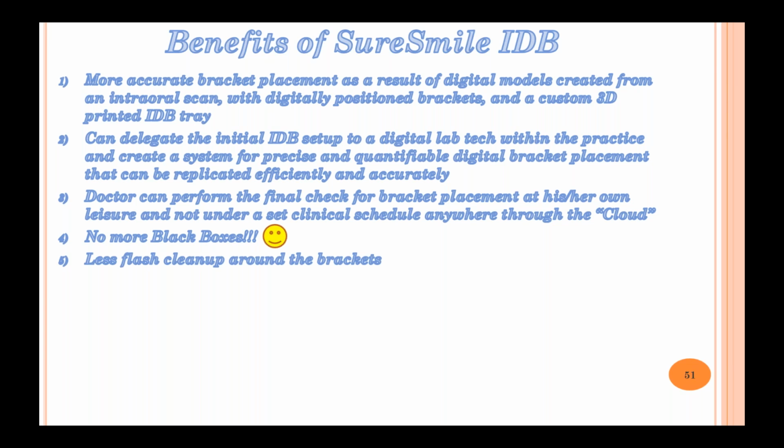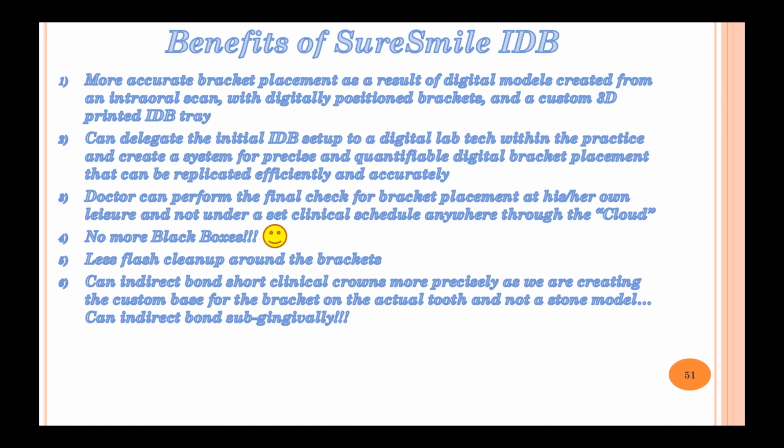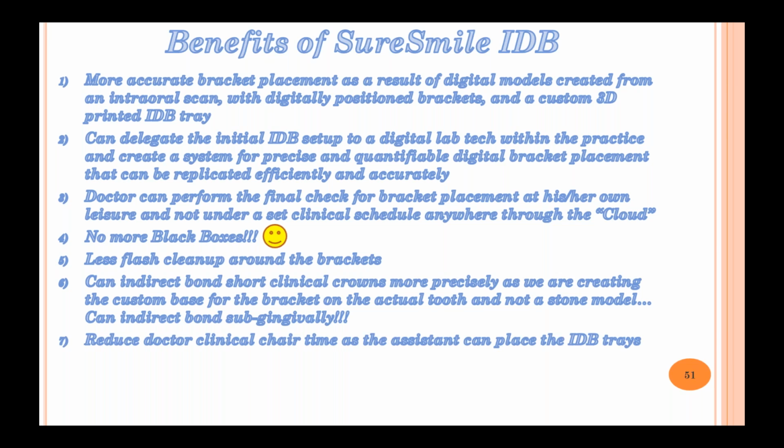The only area of issues that we need to be concerned about is the occlusal or the incisal. Can you indirect bond short clinical crowns more precisely, as we're creating a custom base for the bracket on the actual tooth and not on a stone model? On a stone model, you're stuck. I've talked to people, and I've done it myself, where you take a Columbia Dentoform carver and carve a little bit of the stone model away, but how precise is that? There's error there. Here, the software is finding the most precise 2-point contact, and you can set it down into that virtual gingiva if you want. It just can't be too far, but it can be down a little bit. And so we can now indirect bond subgingivally, and I showed you that with that first case that I presented.